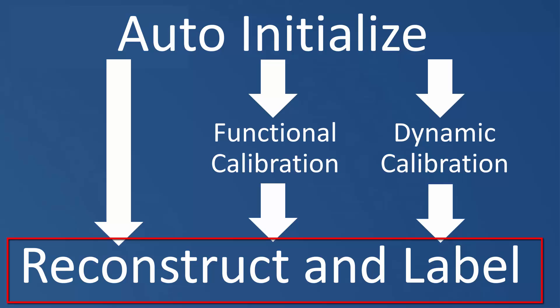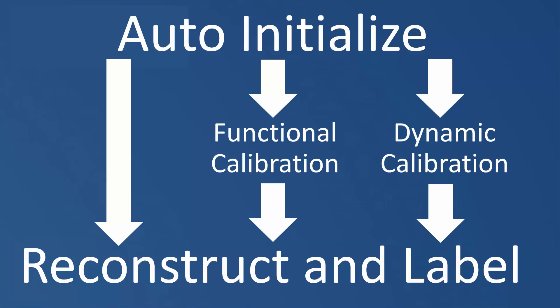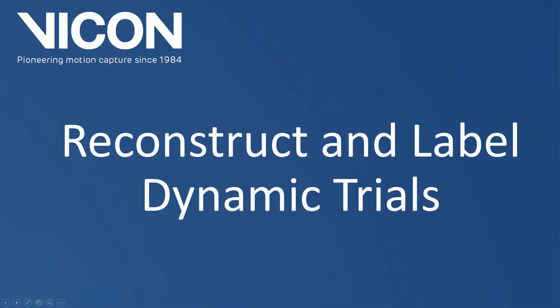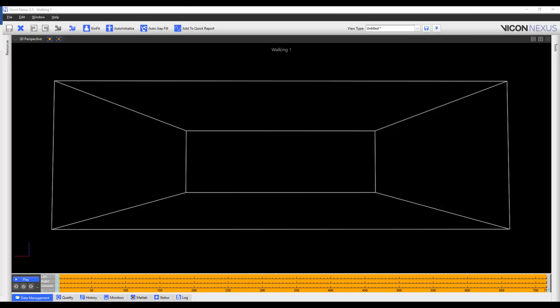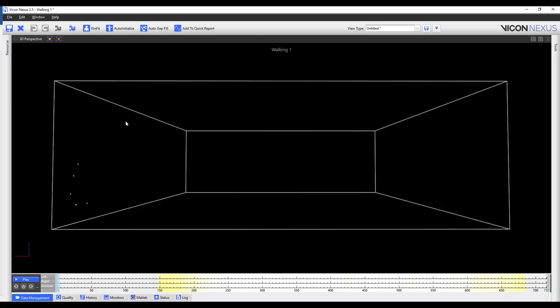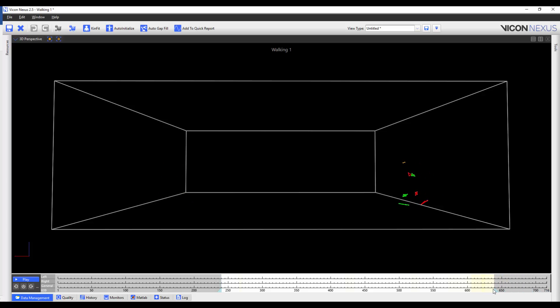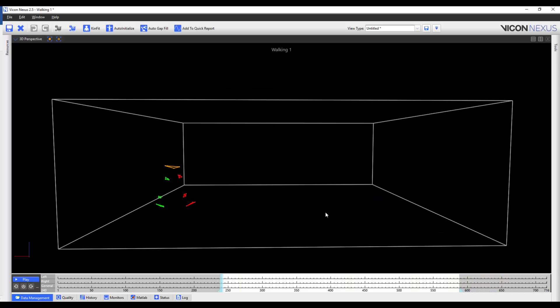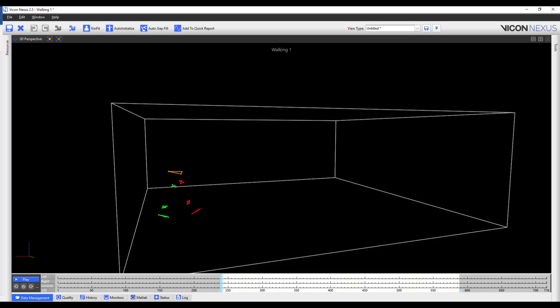I can now continue to reconstruct and label the rest of my dynamic trials, which is what I'm going to be showing you in the next step. I've now loaded another walking trial, and I'm going to reconstruct and label it. I'm also going to crop it to where the subject first enters the capture volume, and to where the subject leaves the capture volume. And now I'm going to assess the labeling.